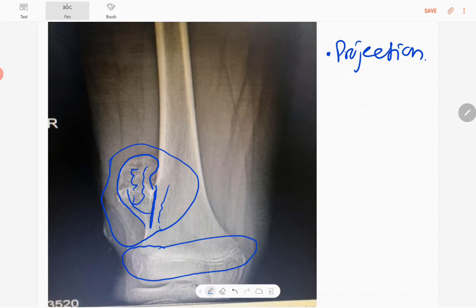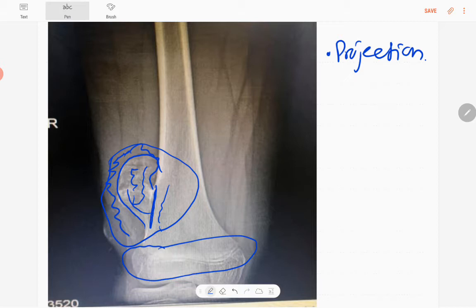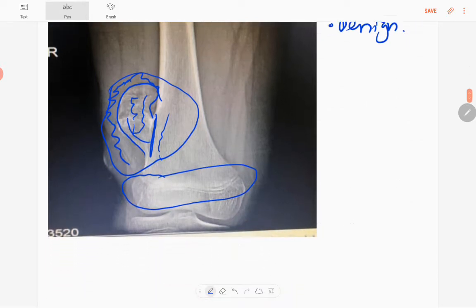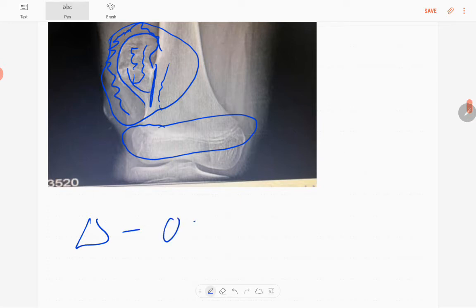There are no other lesions elsewhere and no NVB involvement. No fractures, no soft tissue mass in this region, no ring-and-arc type calcifications in the surroundings, and no periosteal reaction — so it is a benign lesion. The joint is normal. The diagnosis of this lesion is osteochondroma.